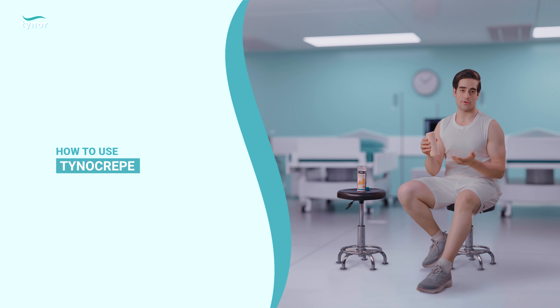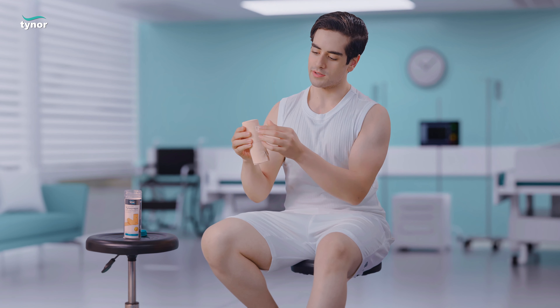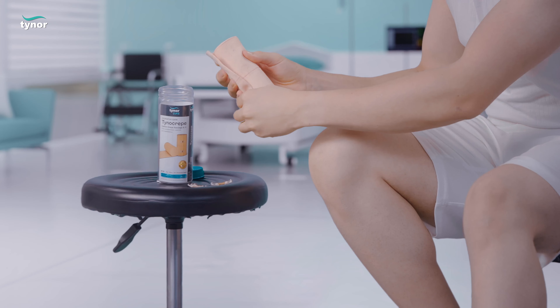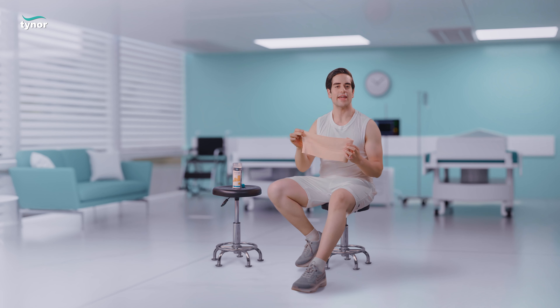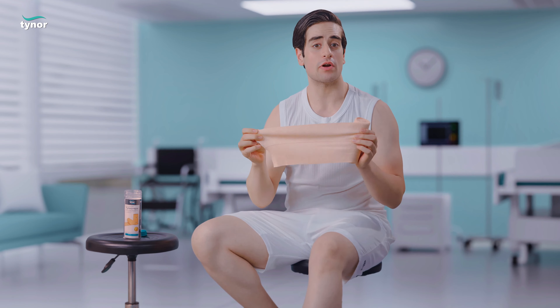Now let me show you how to use the product. Unclip the product before use. Begin wrapping the bandage tightly at the bottom of the knee, hold the loose end in one hand, and use the other hand to wrap the bandage in a circular motion.